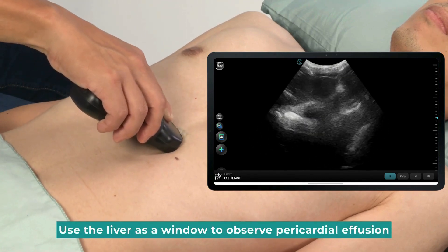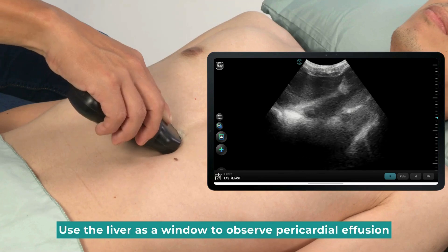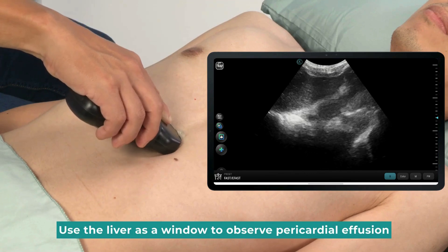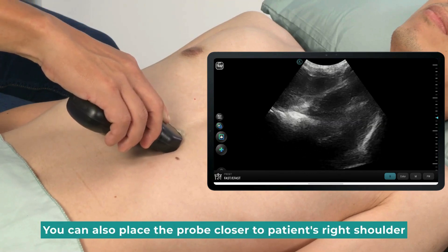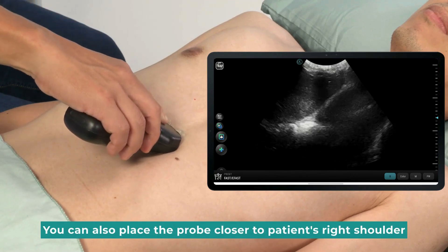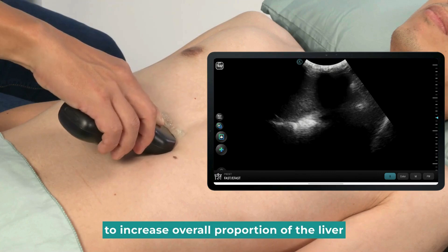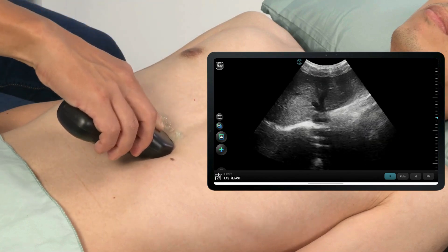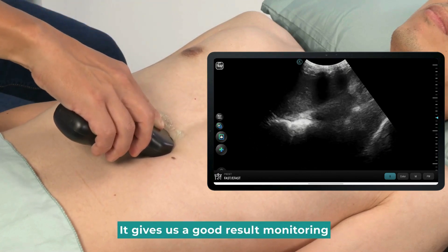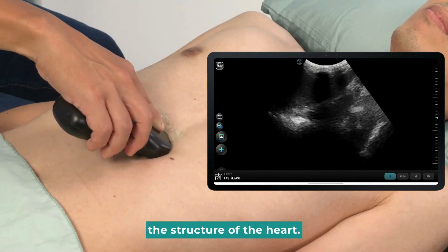Use the liver as a window to observe pericardial effusion. You can also place the probe closer to the patient's right shoulder to increase the overall proportion of the liver, which gives us a good result monitoring the structure of the heart.